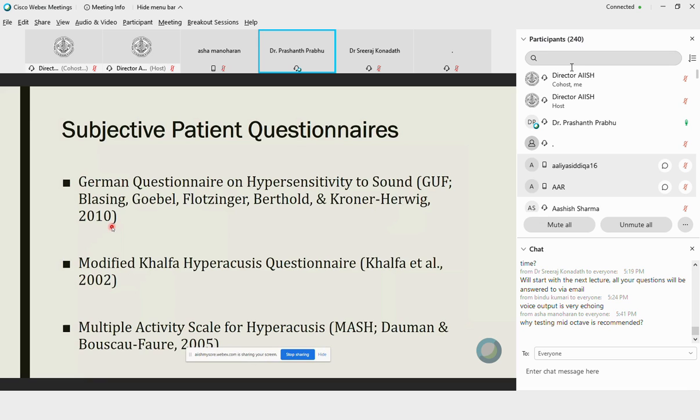And along with this, which tells the degree in the audiological way, another important thing, as explained by Dr. Sriraj as well, is that for measuring the impact of tinnitus in daily life, we have several tinnitus questionnaires. Similarly, even for hyperacusis, it is very important to administer questionnaires to know how much this hyperacusis is actually affecting their daily life. That is very important because that will tell us the real effect of hyperacusis. LDLs are an indirect way, but to know the real life experience, it's always advisable to do a questionnaire and know in which areas the person has difficulty.